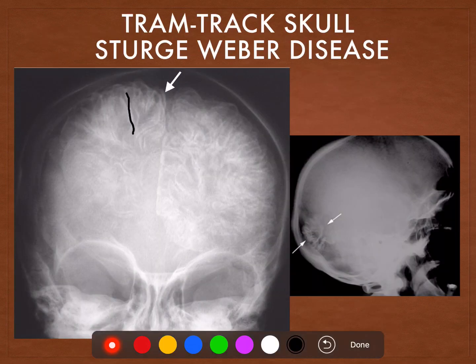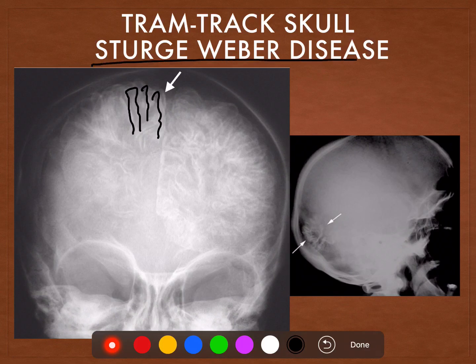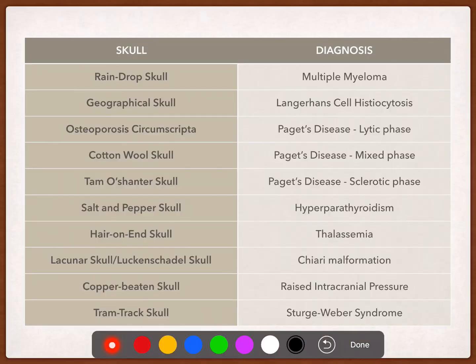Then we have serpiginous calcifications in the skull — these linear calcifications are known as the tram track calcifications, or the tram track skull, and is characteristic of Sturge-Weber disease. These linear or serpiginous calcifications are actually gyral calcifications that are along the gyri of the cerebral hemispheres.